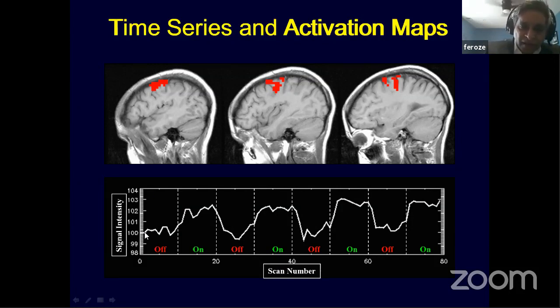If you look at the graph here, the graph starts not from 0, but at 100. And people at that time were wondering what this is all about. Now we know that the brain doesn't rest. Brain is active all the time, right? So people started looking at why this signal is always present, and found out that there are small low frequency fluctuations in the brain, which can also be measured, and which started this whole new field of resting state fMRI. We'll talk about it a bit later.